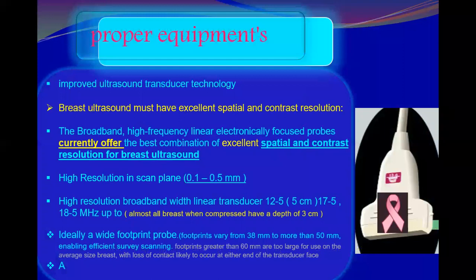So starting with the transducer, breast ultrasound should have excellent spatial and contrast resolutions. And the broadband high frequency linear electronically focused probe currently offers the best combination of both excellent spatial as well as contrast resolution for breast ultrasound, up to 0.1 millimeter resolution.